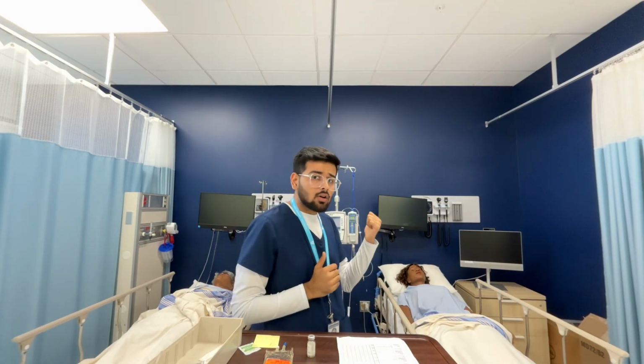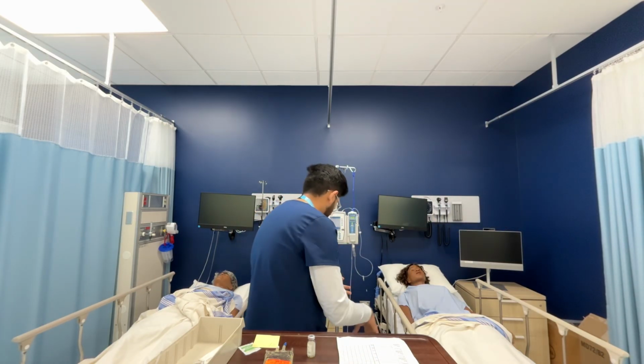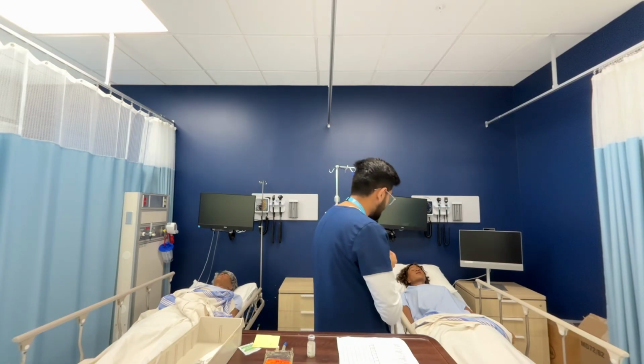Now I'm going to go to the patient, and I will perform my further evaluation. For that, I'm going to do further assessment: knock, hand hygiene, privacy, safety check, brakes check.